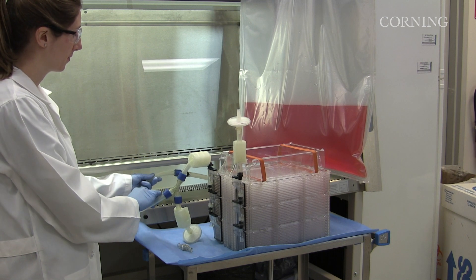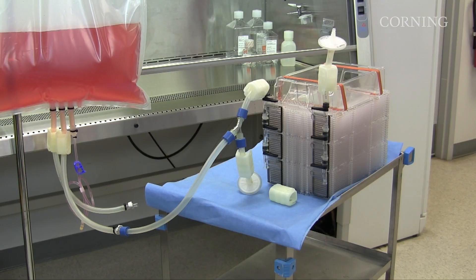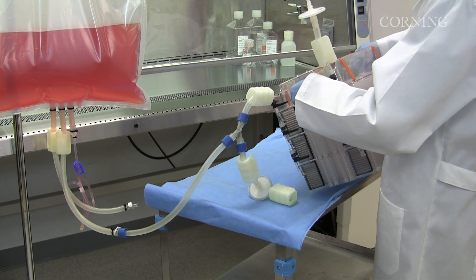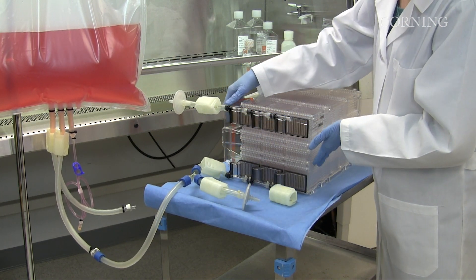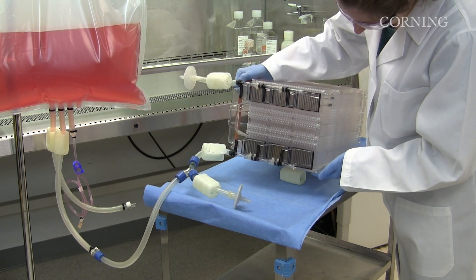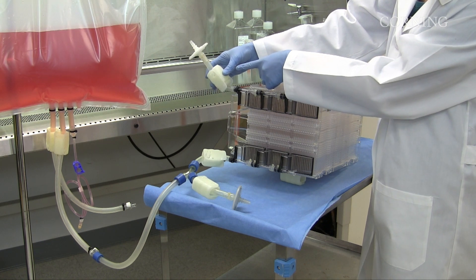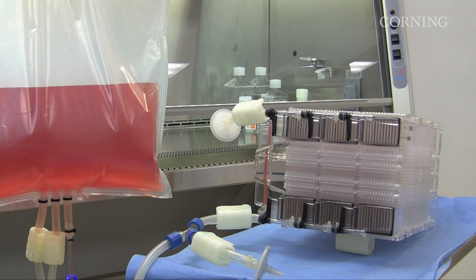The Hyperstack is a closed system, so it can be located outside of the hood. After making the aseptic connection, place the Hyperstack vessel on its side in the fill position. Place a clamp or other small object beneath the vessel to raise the front end about 10 degrees. The air manifold should be at the highest point of the vessel. Position the source vessel at the same level as the Hyperstack vessel.